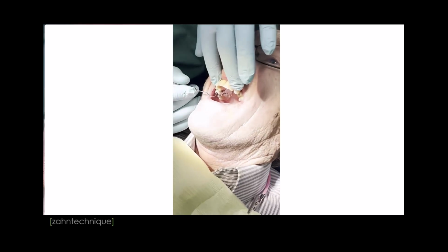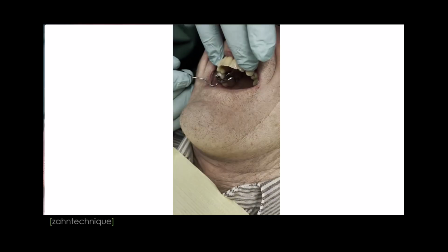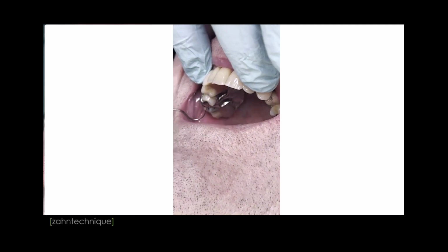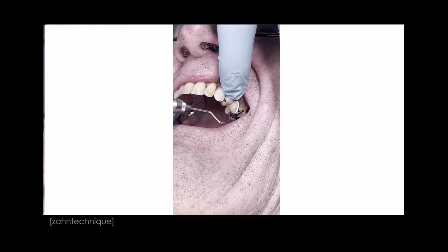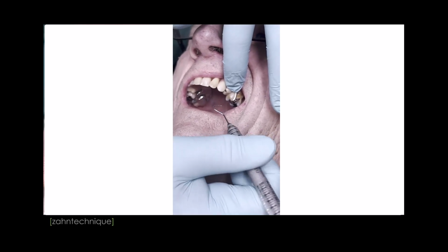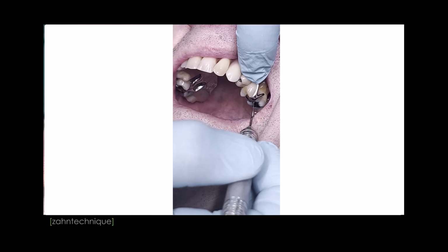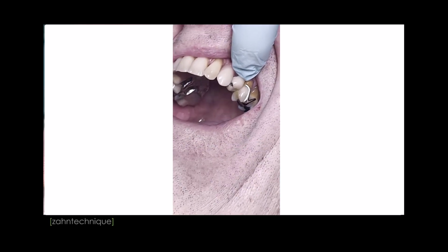A lot of times, going back to the lab, we pour a model and go digital from there. We scan the model, design a partial. Like Veronica mentioned, we can print a resin partial and cast it, or we SLM the partial. You don't even see that at the very end. You just care about a good fit and good quality, right? So our workflows might change over time more and more, but that's the key, right? Your digital impression or physical impression is basically the key for that final outcome.